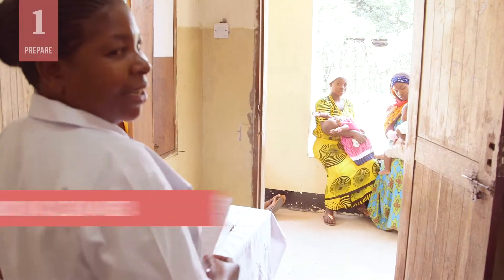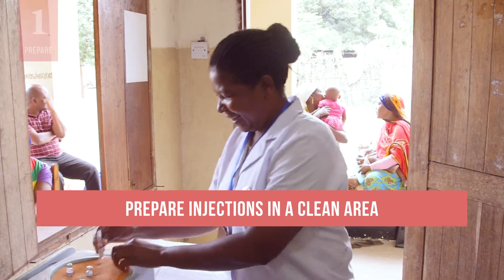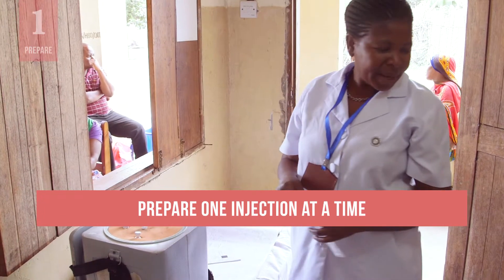First, always prepare the injections in a clean, designated area that is free from blood and body fluid contamination. Only prepare one injection at a time.